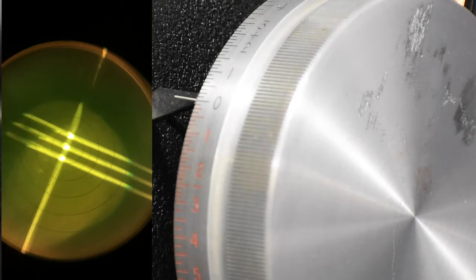Okay, we're gonna perform a lensometry. How about that? All right. So I already got the glasses in place, and we got them on the stage already clipped on there and appropriately aligned. So we can see we've got the different rings here on the inside of the lensometer, and you can see that we've got three very thin lines real close together and three thick lines kind of further away from each other.